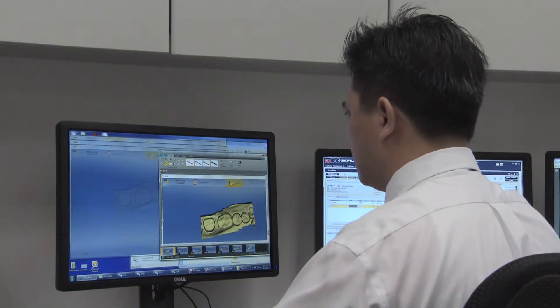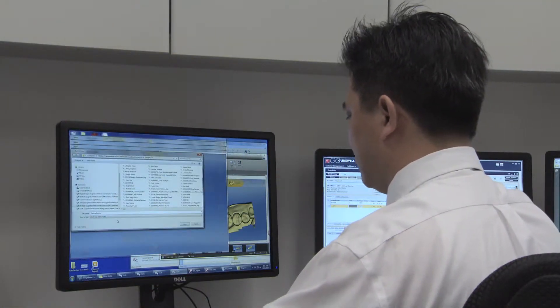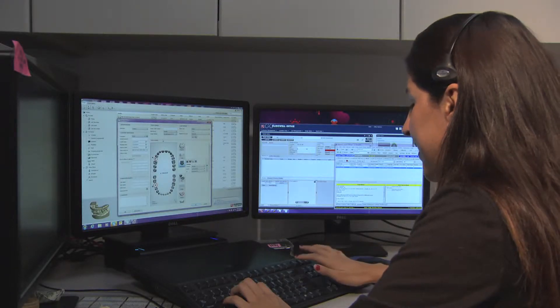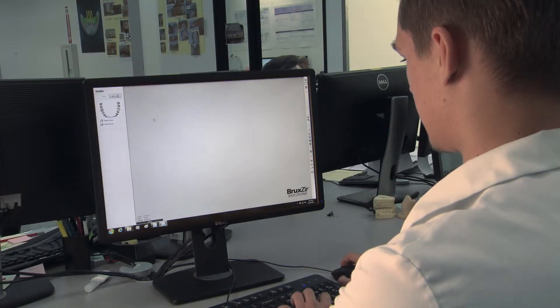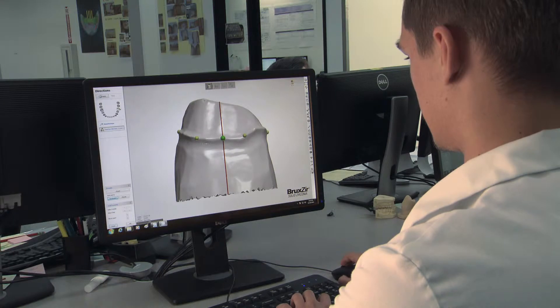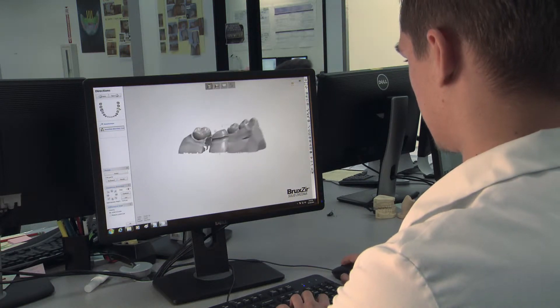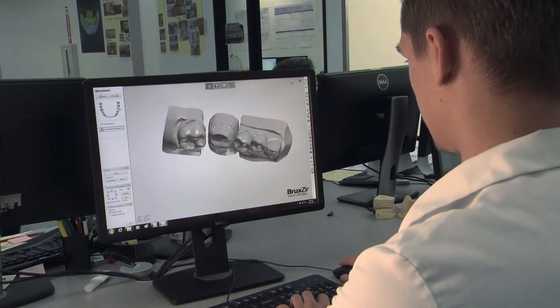After ensuring that the delivered STL scan files are functional and adequate and that the prescription details are logged and clear, the case folder is routed to the appropriate department. With nothing physical to prep or scan, CAD designers can immediately load the virtual models into the dental design software and begin to create a quality restoration.